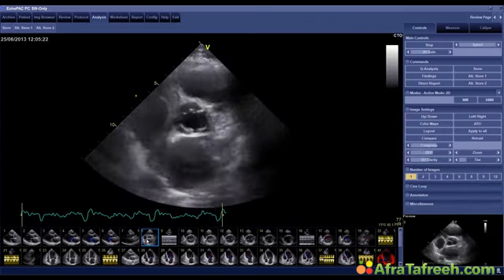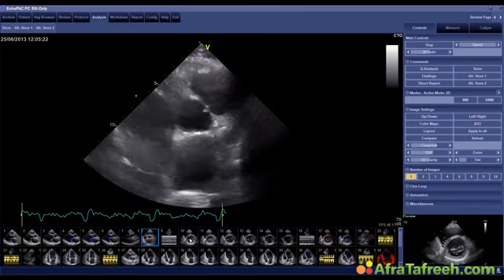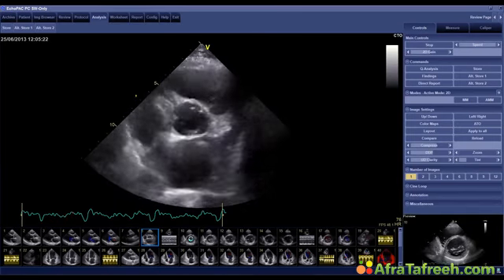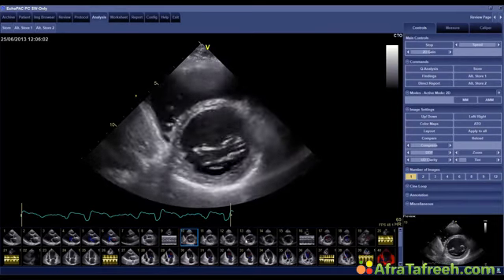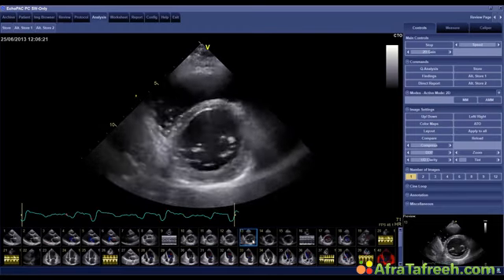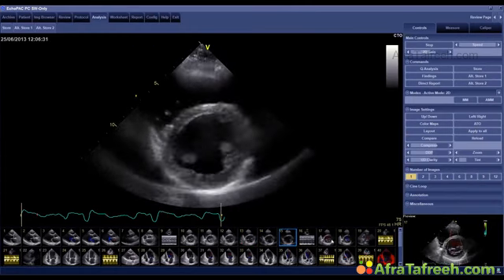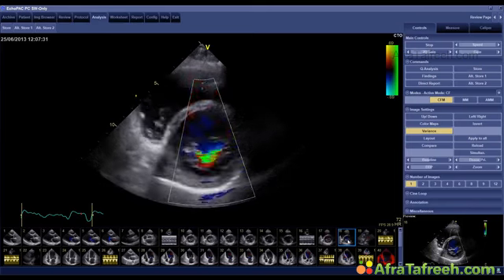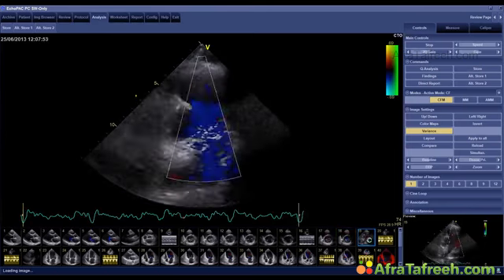So just imagine you are now in the driving seat, and just from this echocardiogram, try to derive all the information you can, and then come to a final decision as to what you think the patient, first of all, has, what his problem is, maybe even why he has the problem, and then ultimately what his clinical situation is.